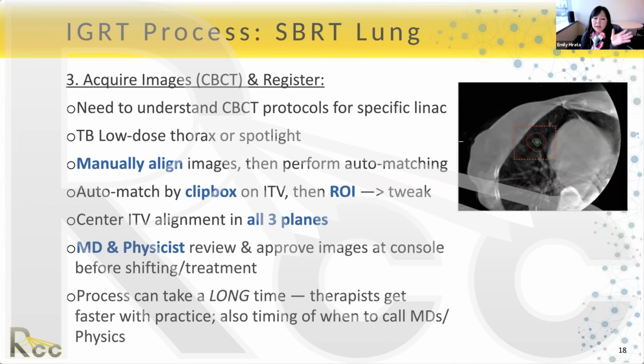This is really important, and I'll come back to this at the end. The therapists are learning how to do this, especially when you're first starting. As a physician, you understand the clinical case. You understand the tumor, you understand how you did your PTV, you know the clinical parameters for this patient's case.